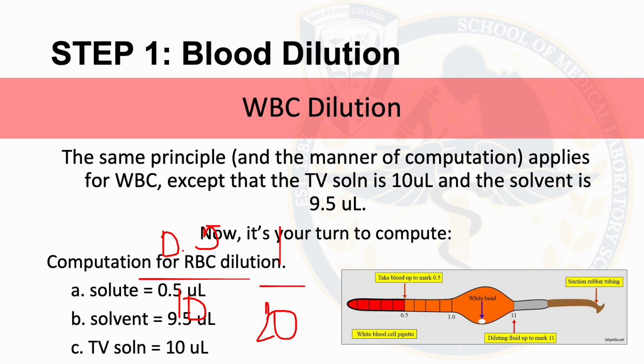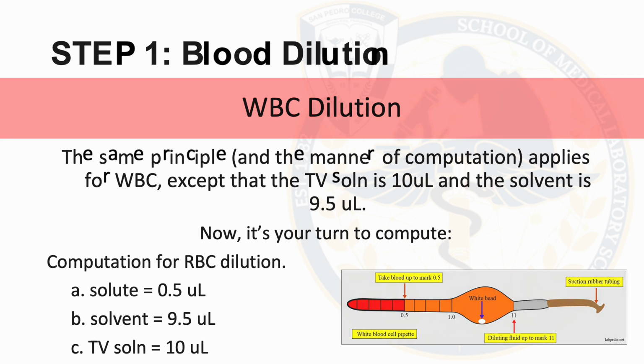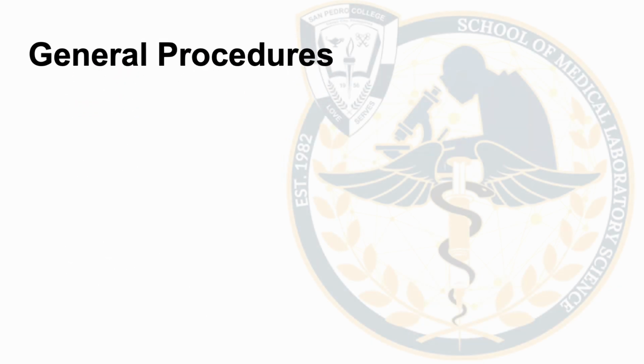Please compute that one, so you can have first-hand experience of how to compute your dilution. Okay, so let's proceed now to your general procedure.